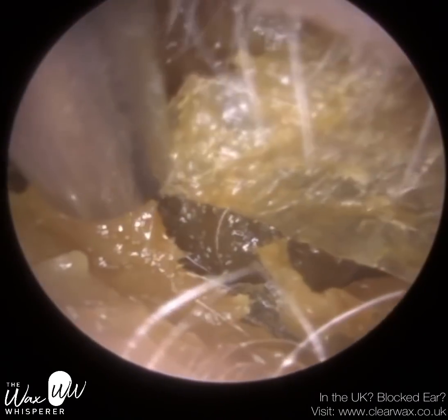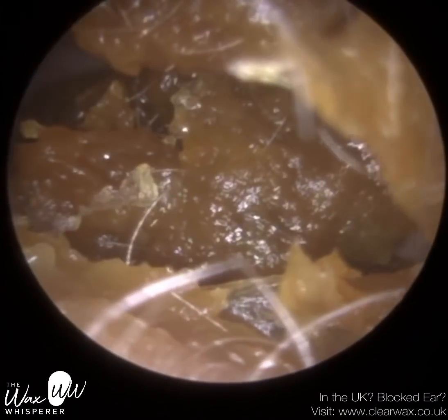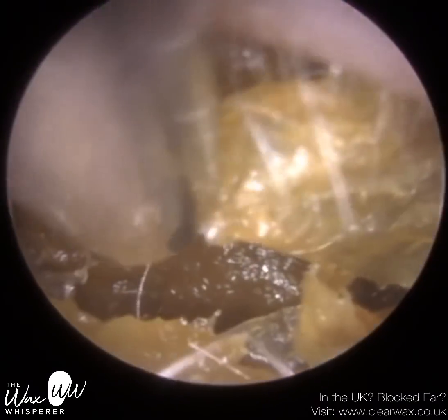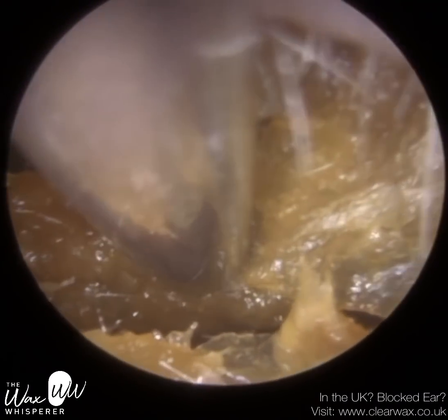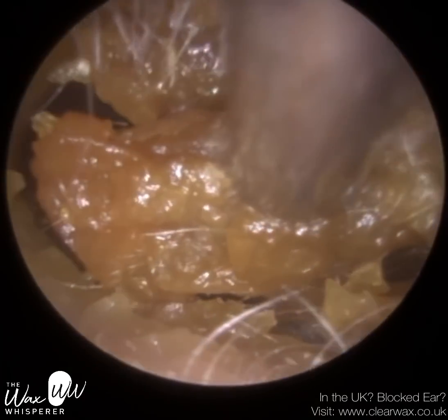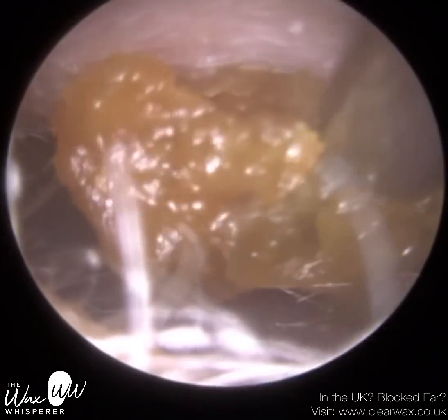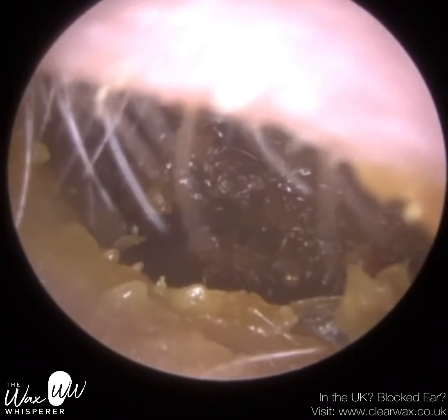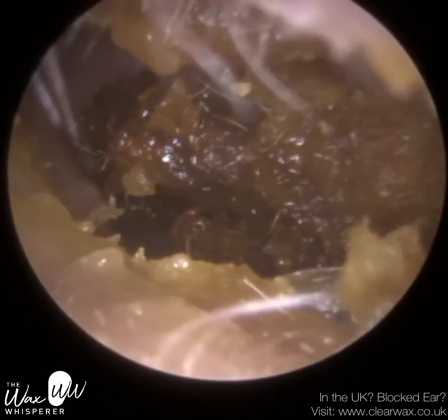Whilst you watch the procedure and me removing this dead skin and wax, I'm just using microsuction here, I'll explain how surfer's ear and exostosis, however you want to call it, works, and what's the cause of these bony spurs. And if you watch right till the end of the video, you're also going to see the patient's right ear, which has even more pronounced bony spurs.